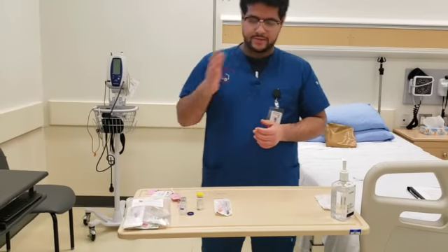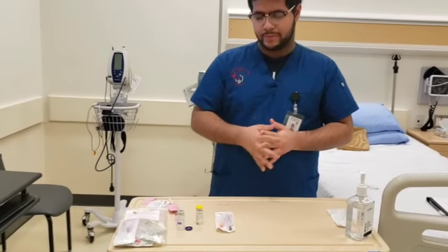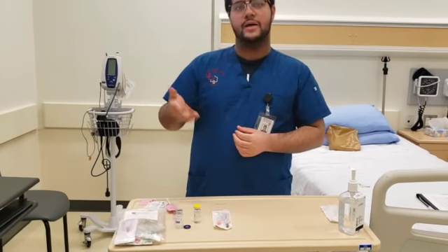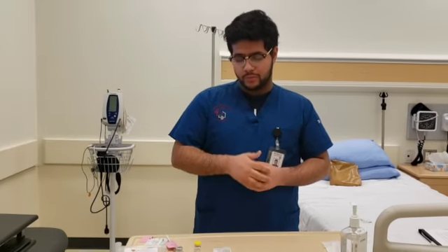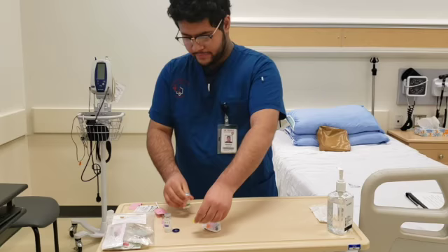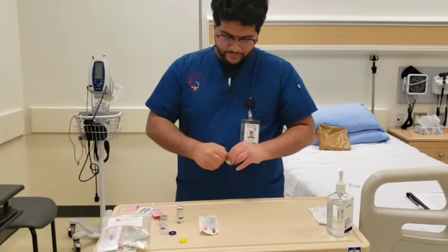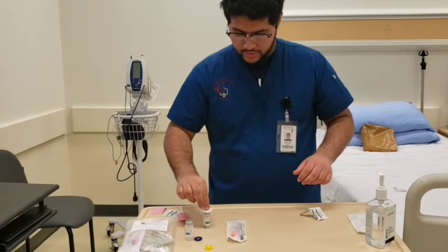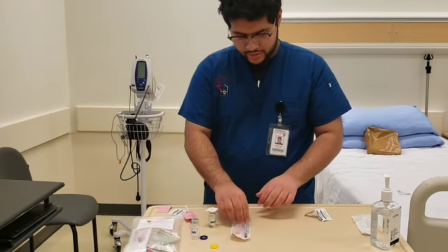Heparin is prepared. The next thing we're going to do is prepare the Haldol. The doctor's ordered 1 milligram. We have 4 milligrams per 2 milliliters at hand, so we have to draw up 0.5 milliliters. So again, the same procedure. We're going to take the cap off. We're going to take the alcohol swab. Just keep it sterile. And now we're going to take our syringe and the needle.